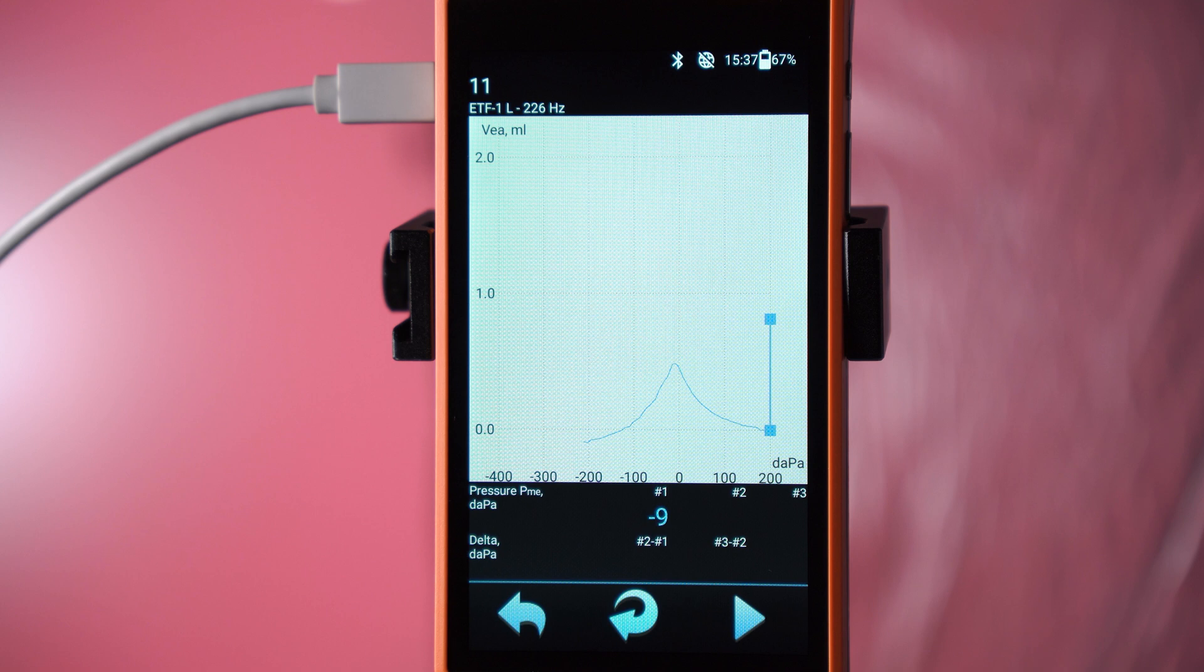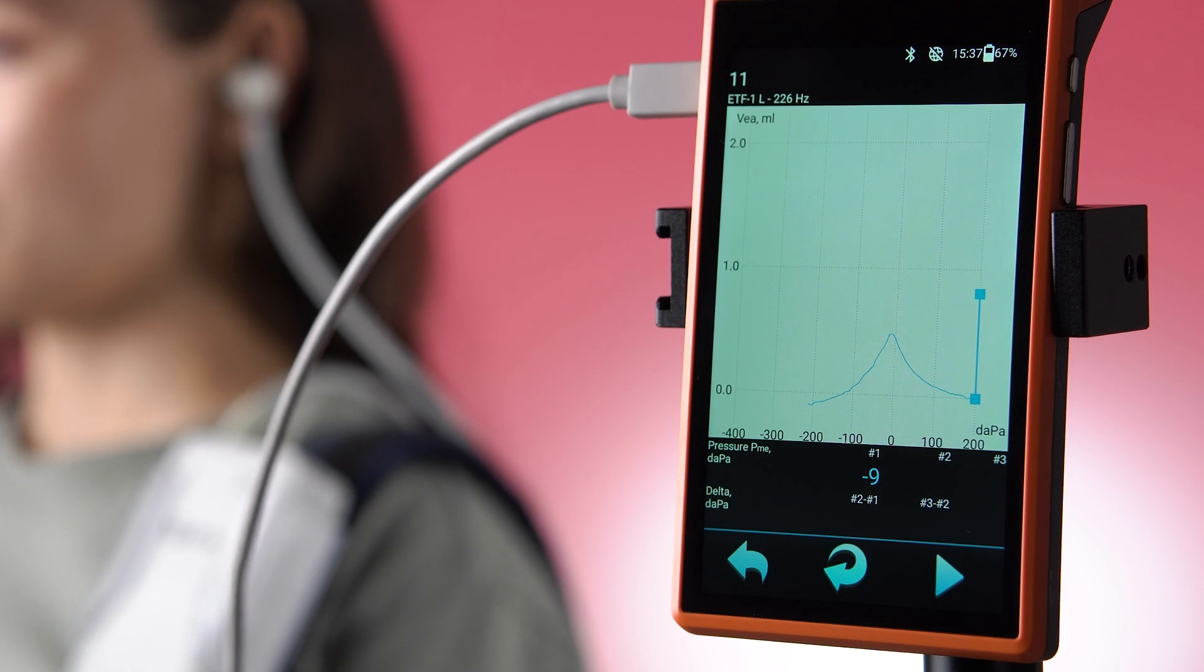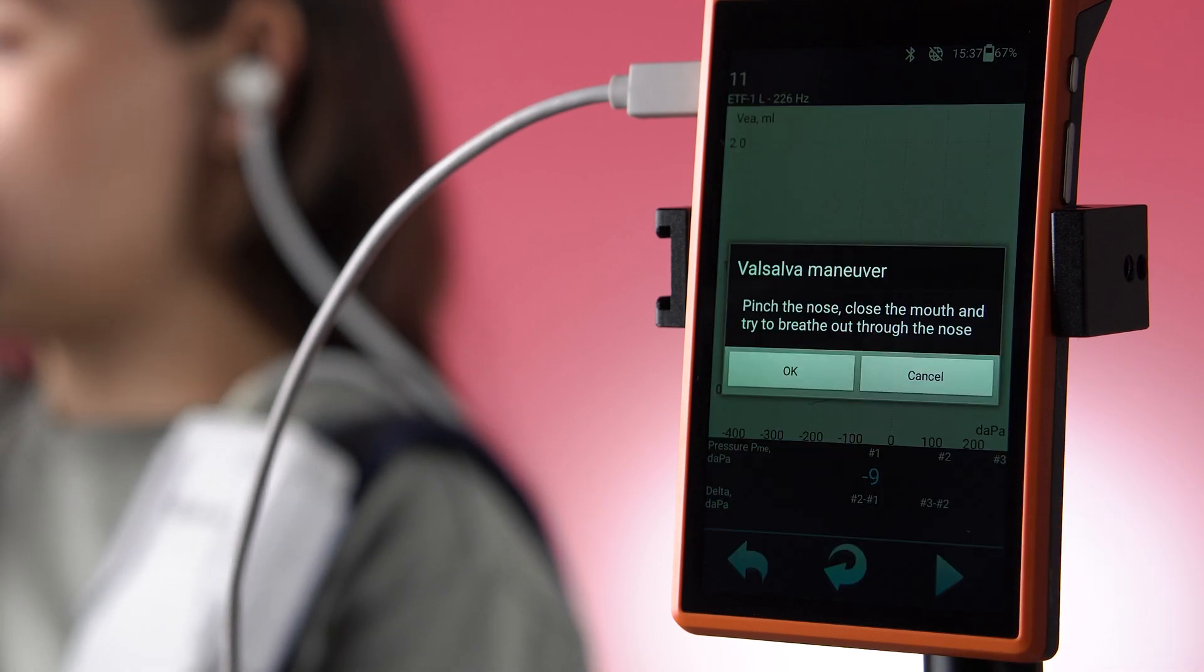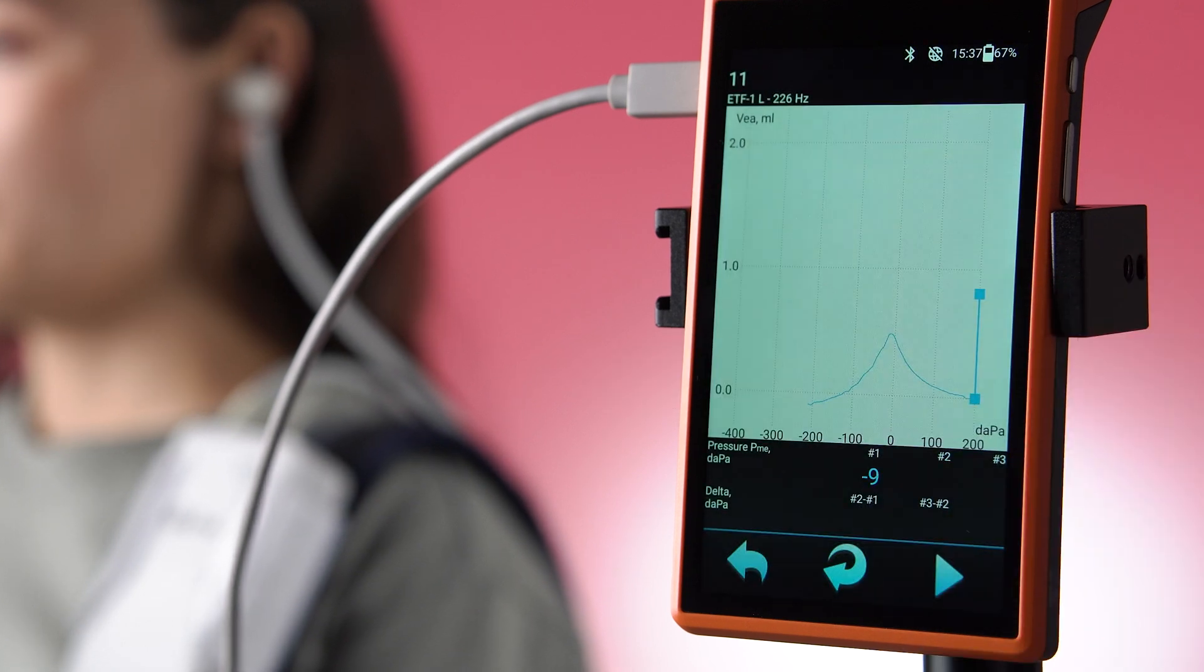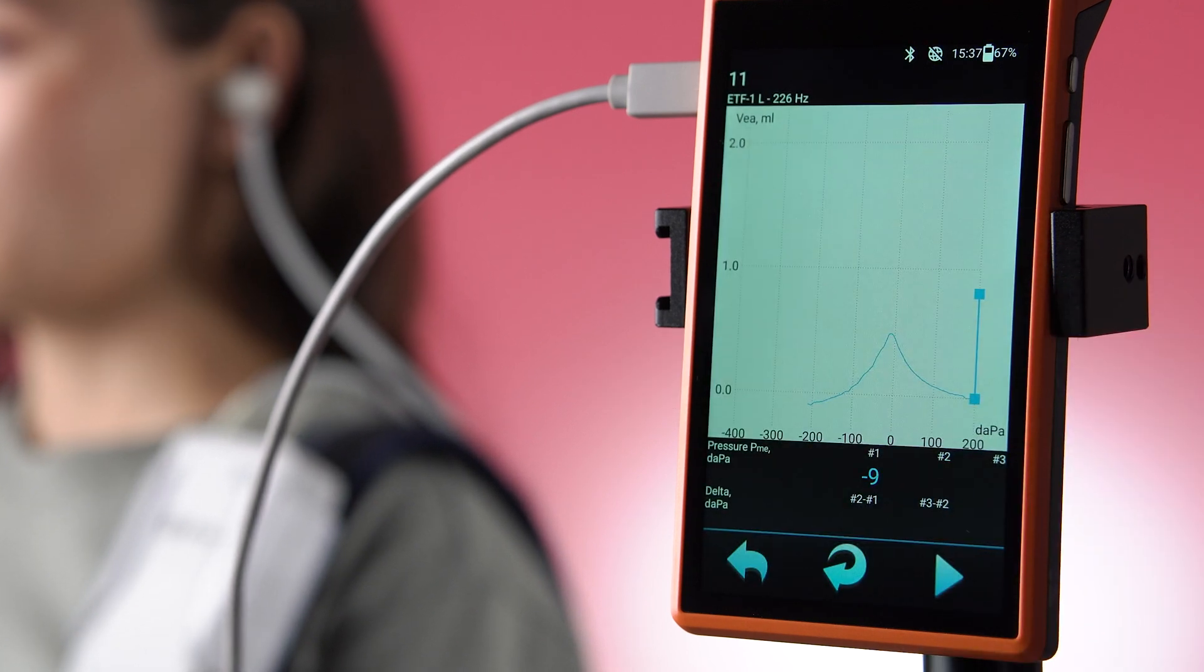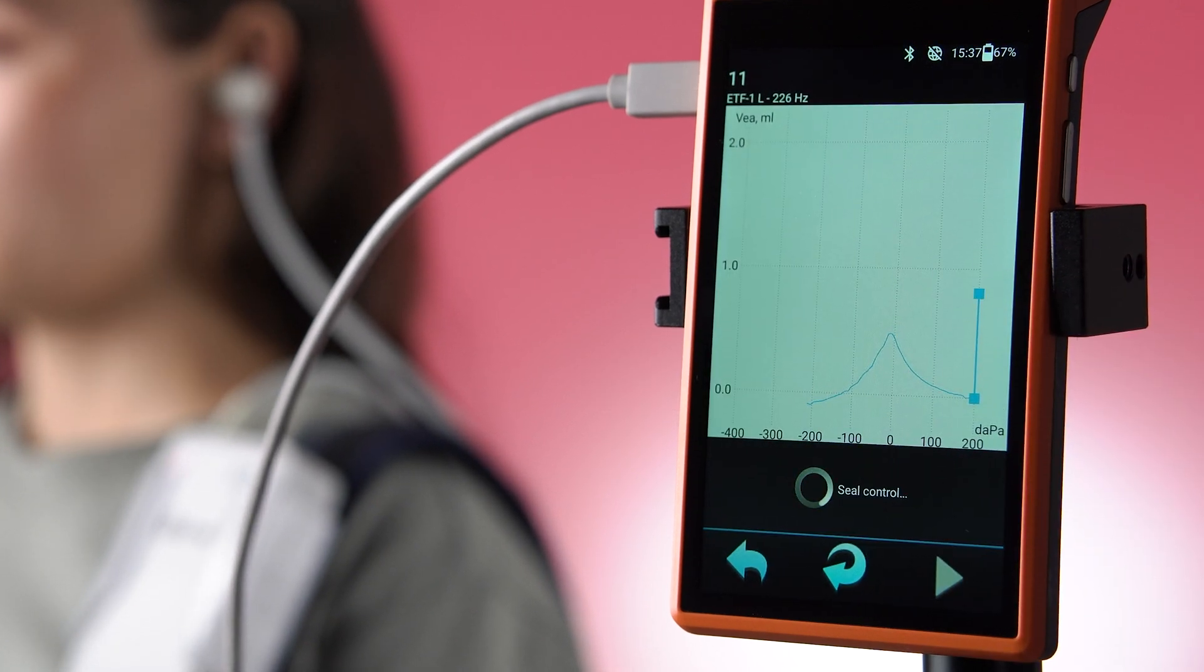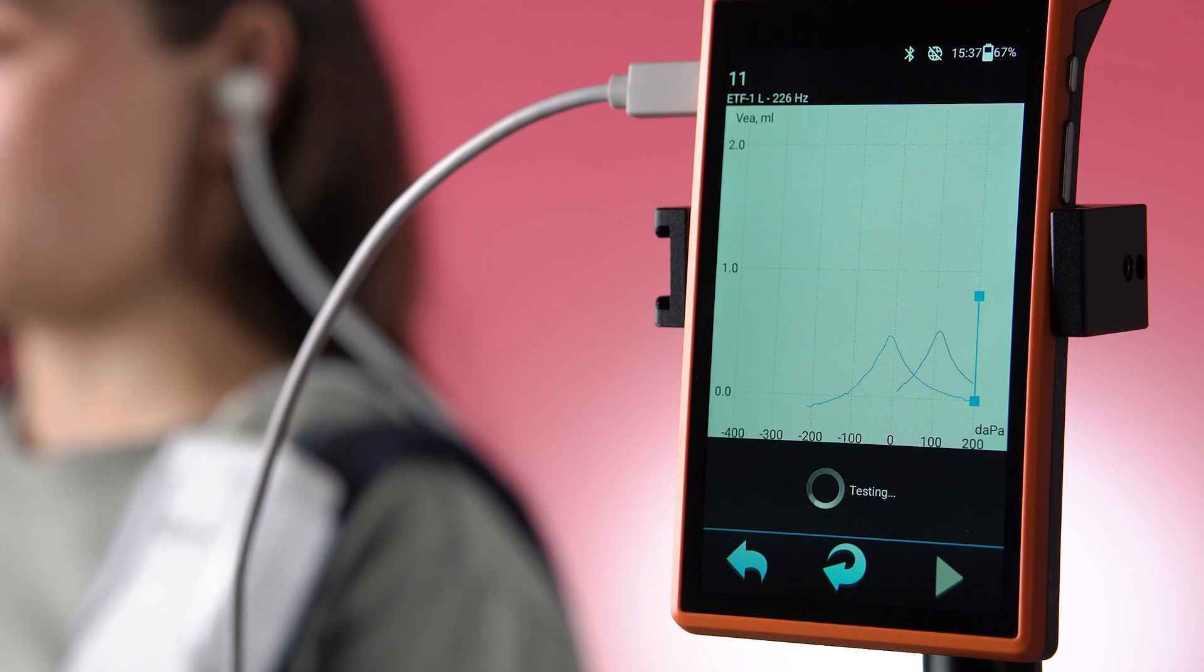A tympanometric curve graph number 1 will appear on the display. After pressing the arrow, instructions for performing the Valsalva maneuver will appear. After the patient performs the maneuver, press OK to obtain the second tympanogram.